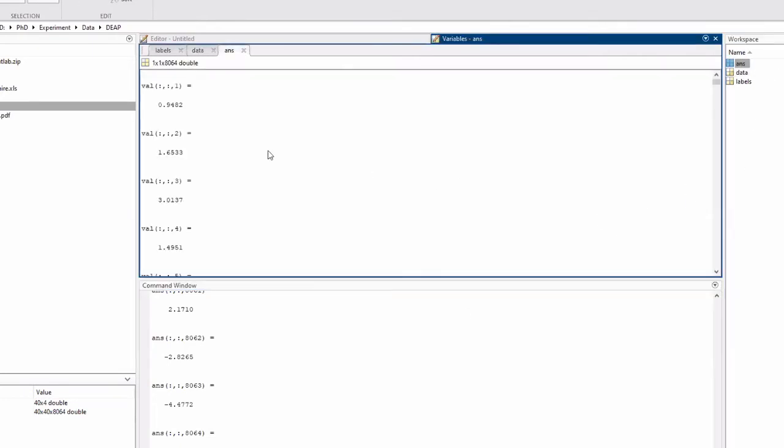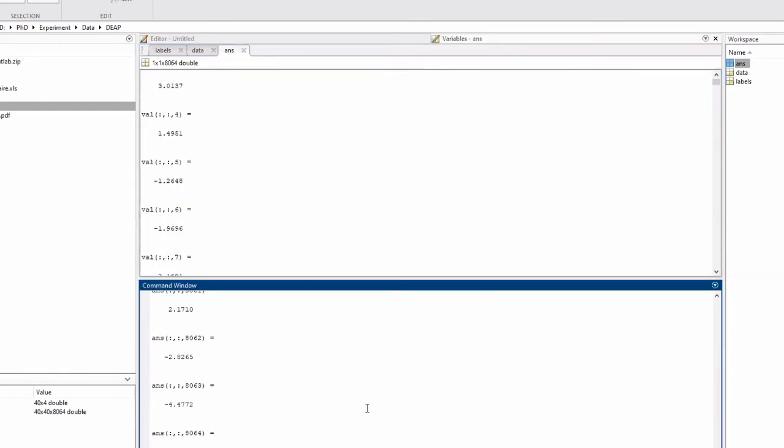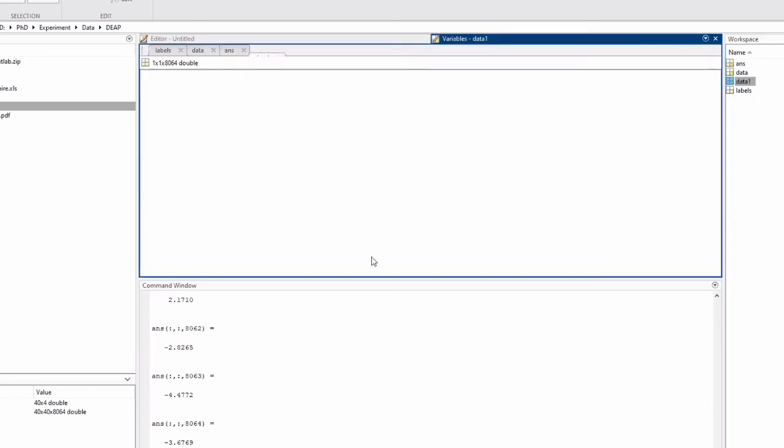And if you double click this, it will show numbers here. So if you want to save it somewhere else, you just name a variable, say data1 equals data 1, 1, everything. And you will have data1 here in this way, right? And you can view this data yourself.